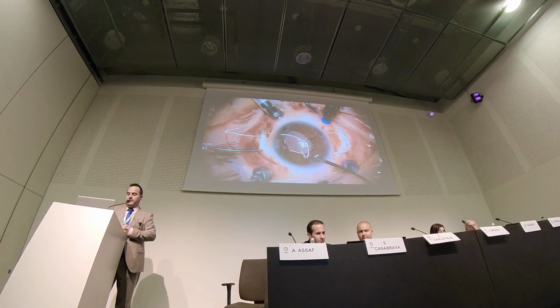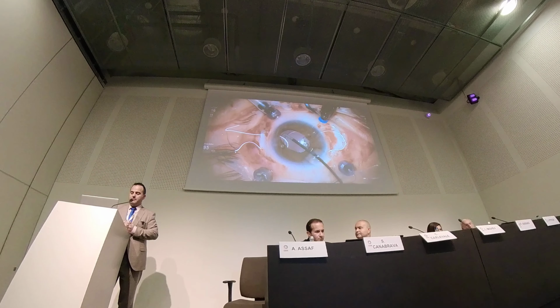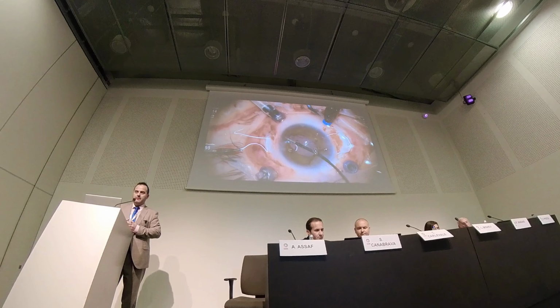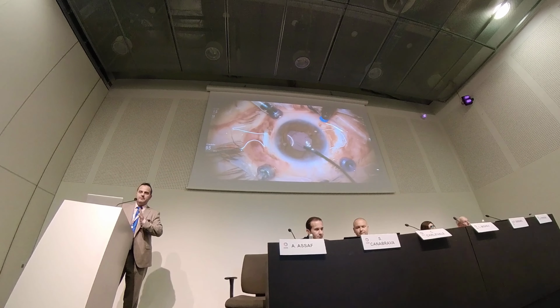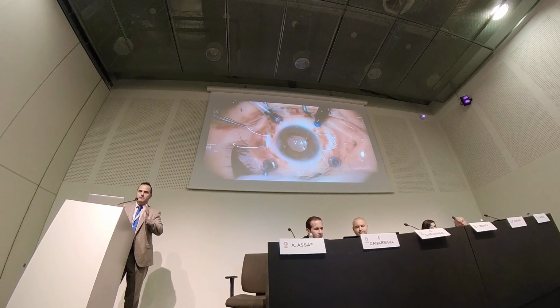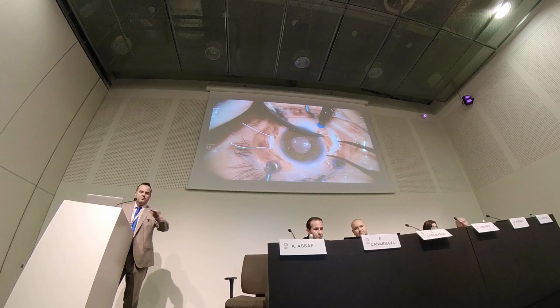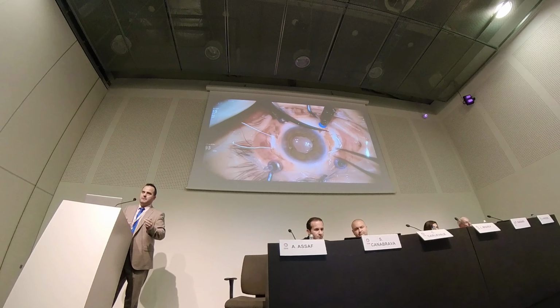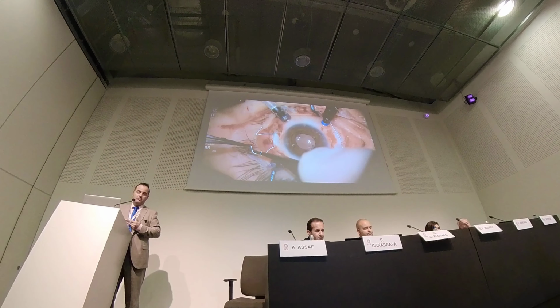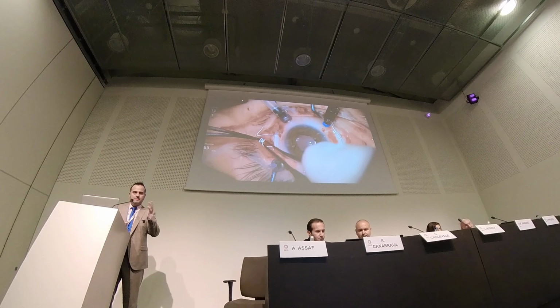So here again with the handshake technique, I pass the suture through the eyelets of the optic, and what I like with this technique is that you can titrate the position of the IOL. You can of course centrate the IOL, which means that you might implant the AO, which is a zero aspheric lens. So it's forgiving with decentration. But if you're a little bit more advanced or more confident, you might implant an EDOF lens as a Carlevale lens.